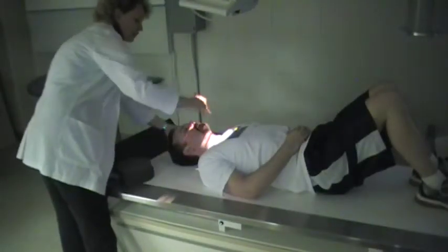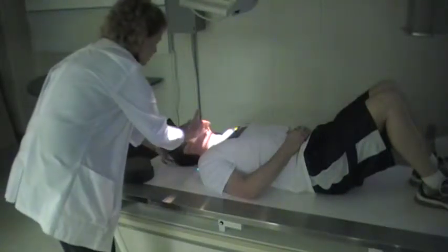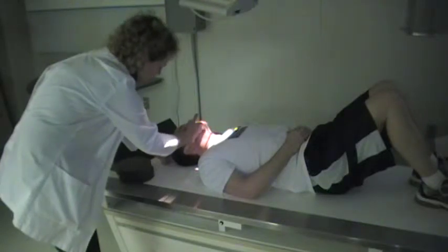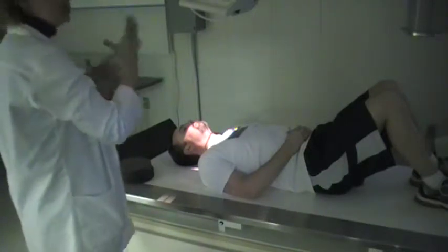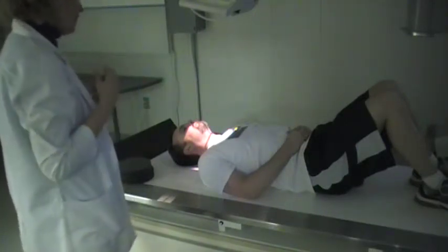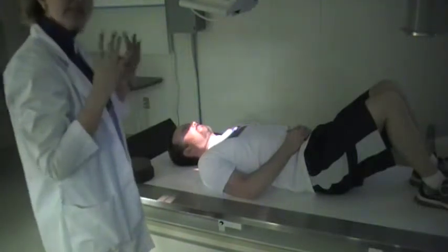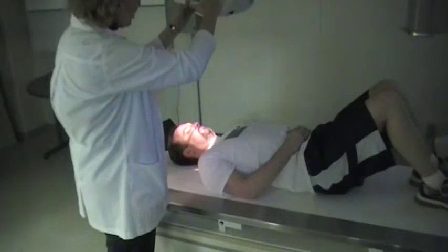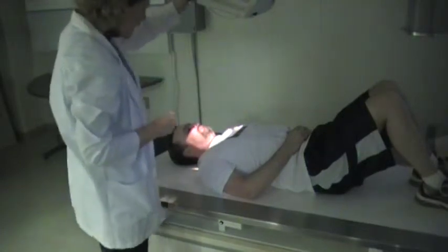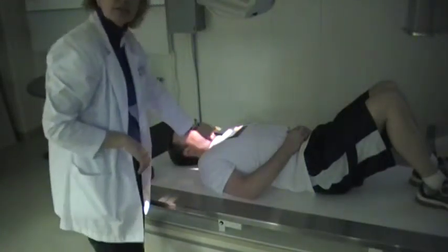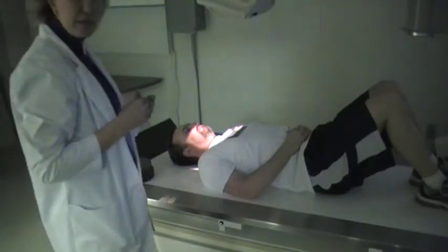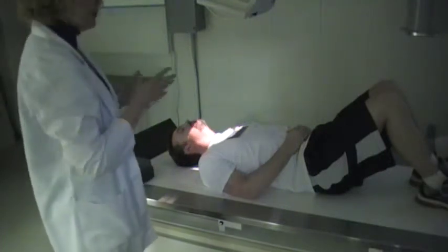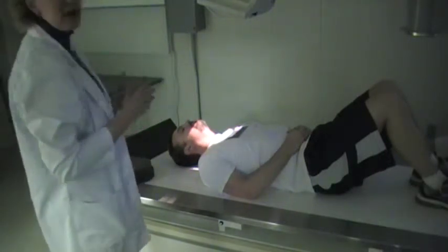Make sure it's mid-sagittal. You can bring the chin up just a little. Usually if the chin is in line with the mastoid tip, that's a nice extension of the head. Now if it is a trauma patient and they cannot extend their head, just put a little bit more angle on the tube and then find the thyroid cartilage and center at that area. It's not always possible for the patient to do complete extension of the head if they are injured.